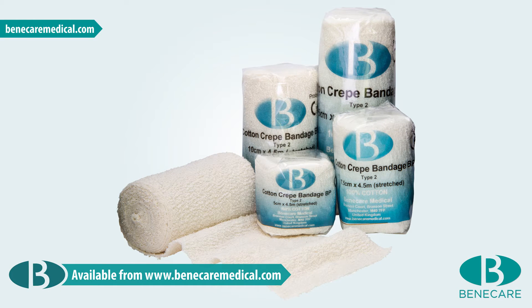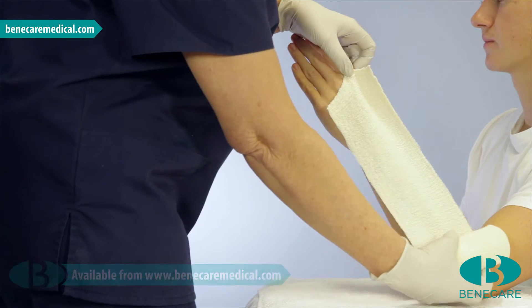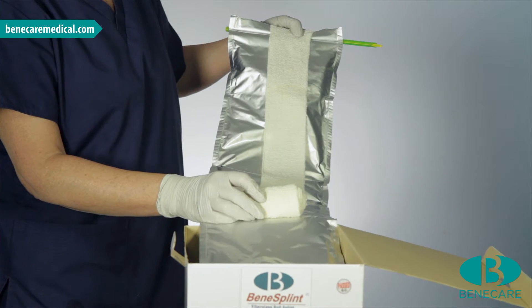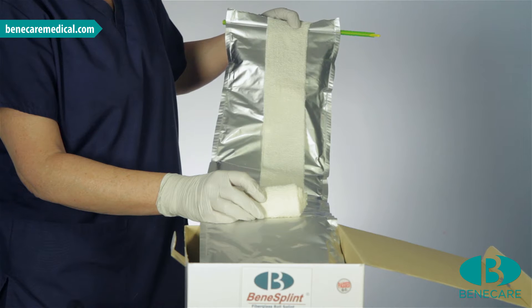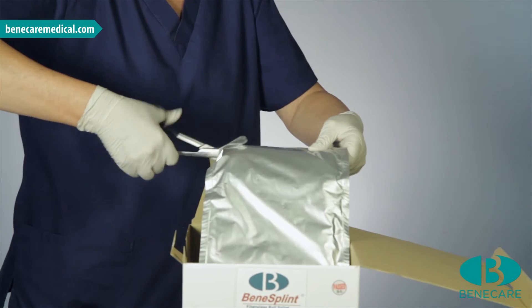Using the 7.5 cm Benecare cotton crepe bandage, measure the limb extending from the elbow to the metacarpal heads. Now use this bandage as a template to cut the splint. Position the bandage at the end of the foil pouch and cut the splint.